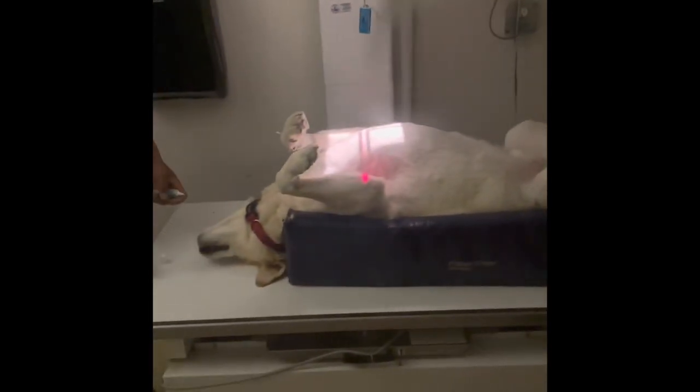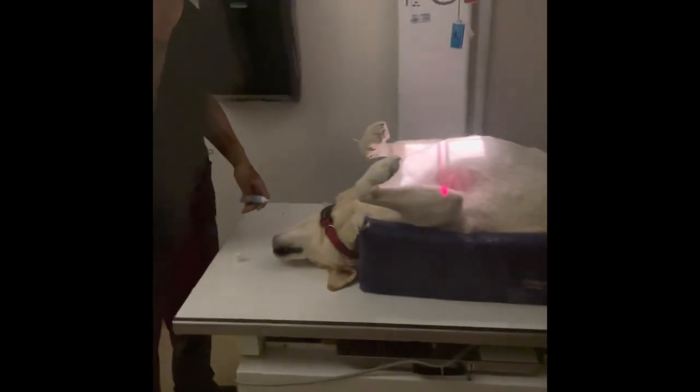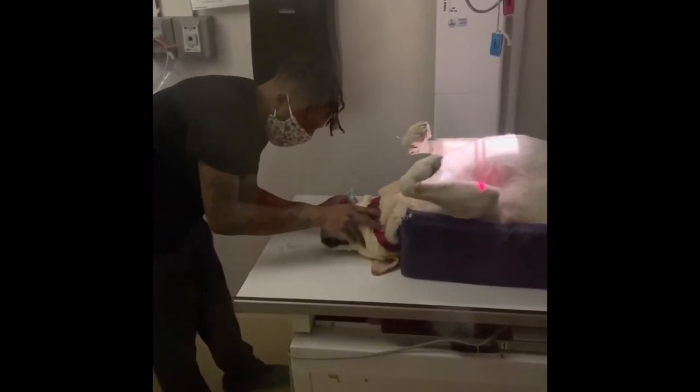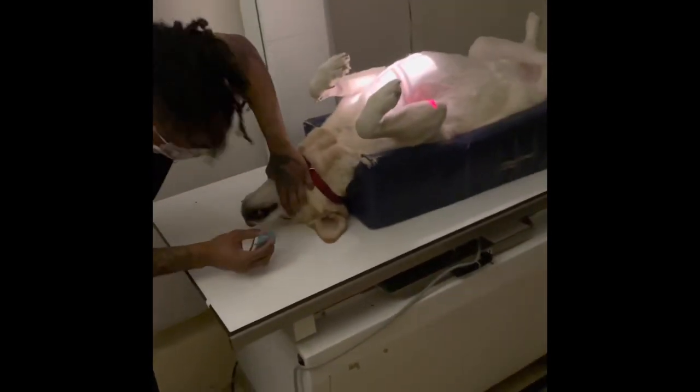Once he's sedated, I'll cut the lights off in the room because light and noise can cause the dog to react and wake up when sedated. After I get him on the table, I'll put some lube in his eyes. Since he's sedated, he may not be able to blink, and his eyes can get dry, which can cause an ulcer. I'll also give him some oxygen to help him breathe.